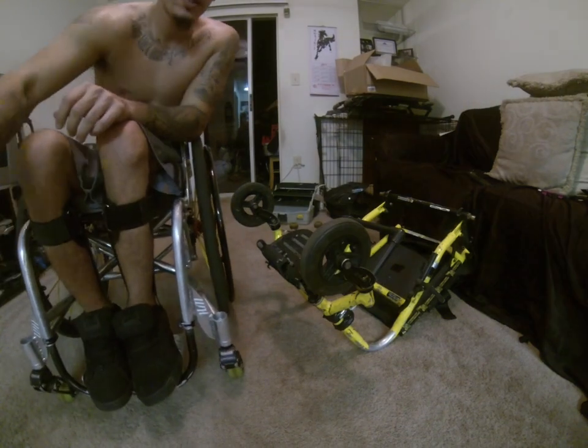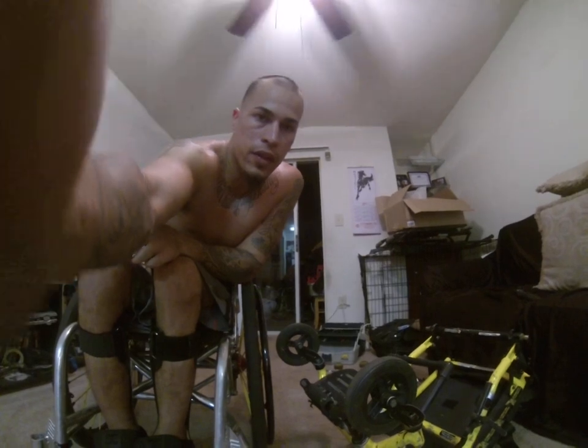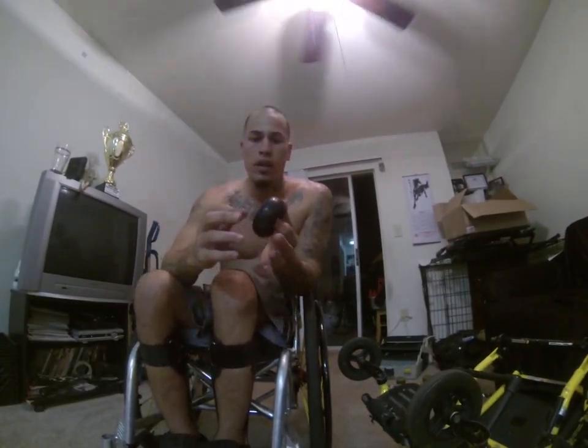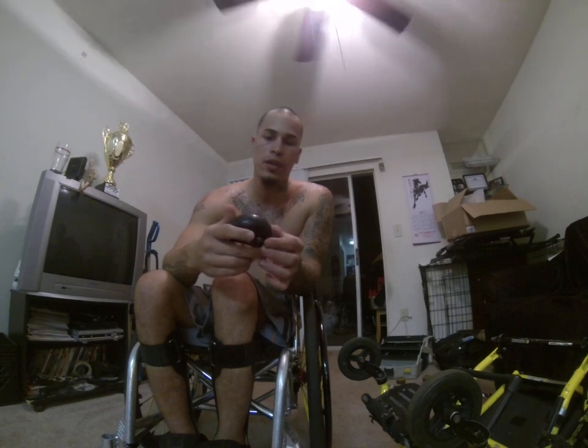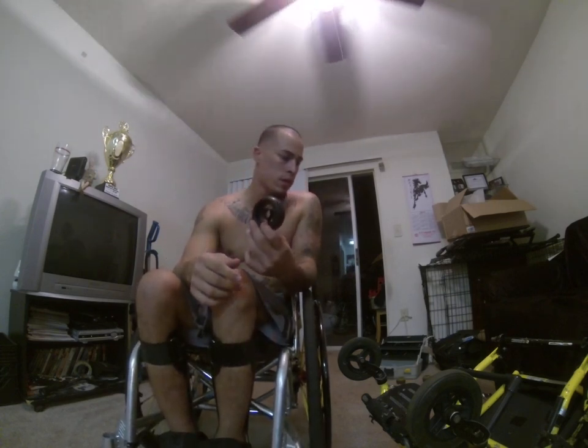Alright, what's up everybody? Today I'm going to make this video on how to change your front casters. I'm making this video for my boy Caleb or Saleb. I don't know how to pronounce your name exactly, but I'm going to make you this video to show you how to change your front casters because he was telling me you have caster flutter.